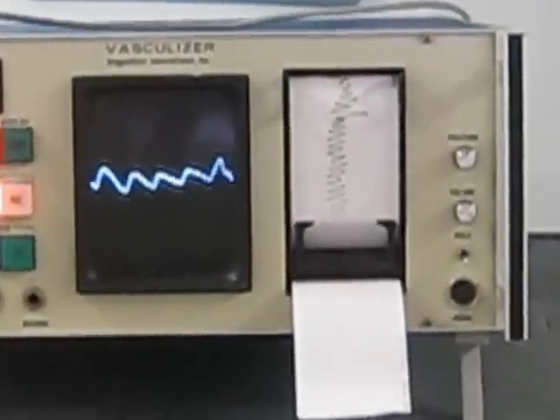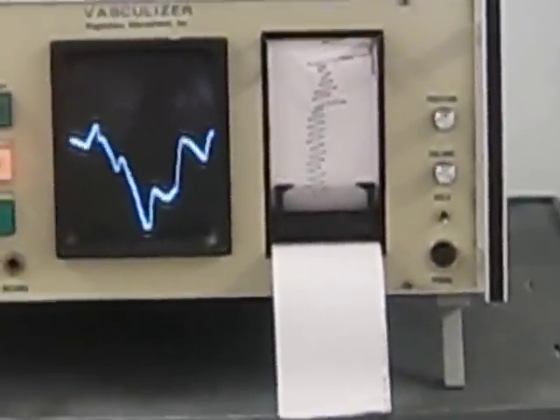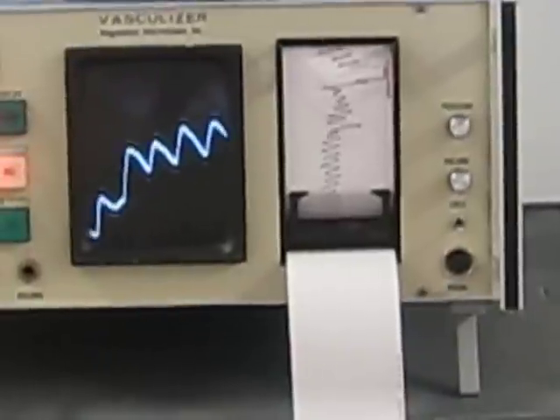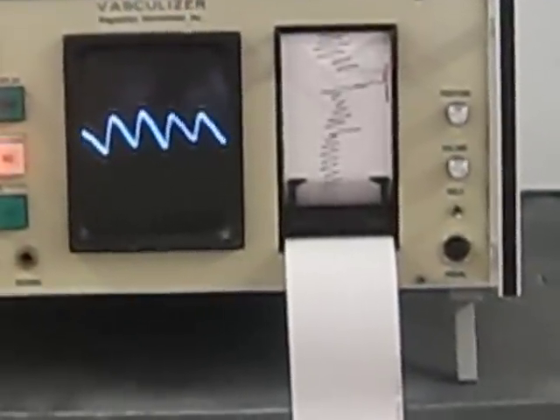We are now going to have her elevate her hand to 90 degrees. You notice that the amplitude remains fine and the wave comes back in regular form.